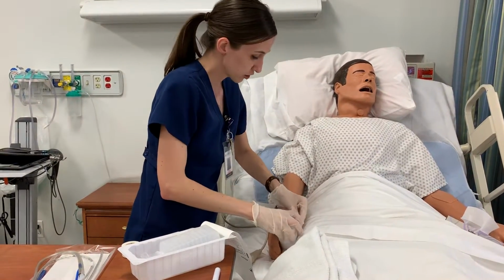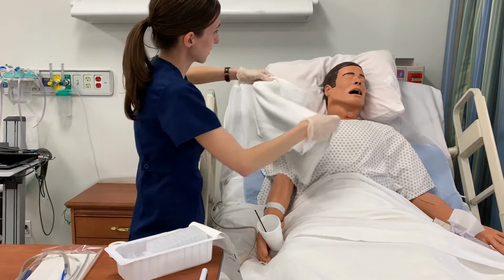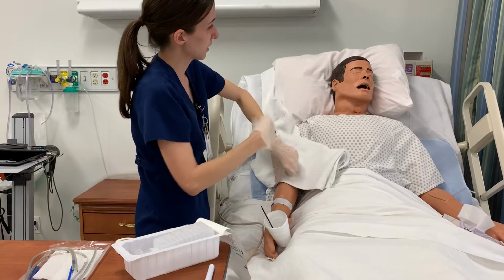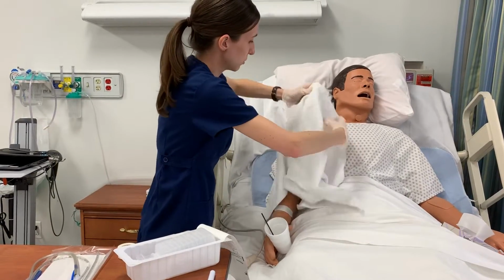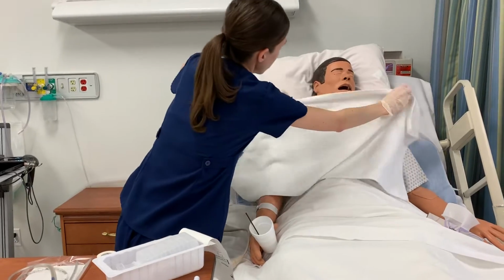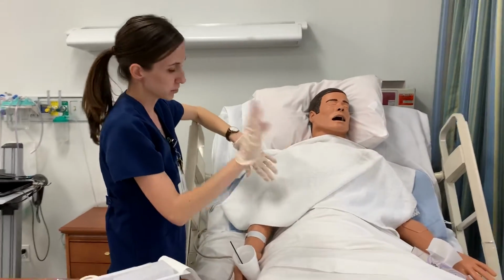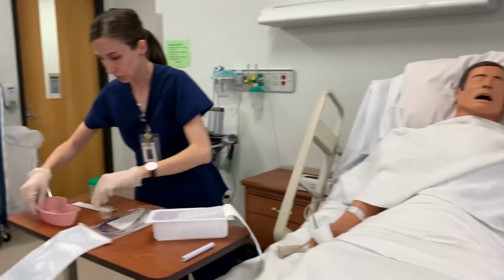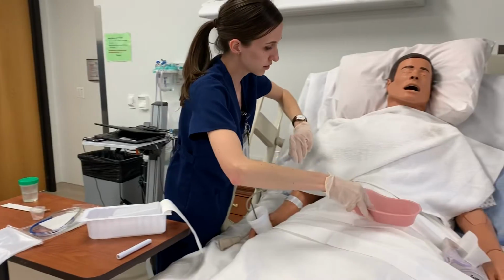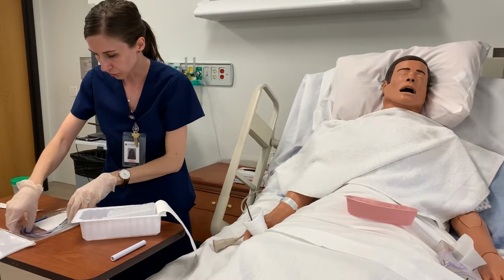I'm going to instruct my patient that during the procedure, I will be asking you to take some swallows, and as you swallow, I will be advancing that catheter. I'm going to place this towel over here. During the procedure as well, if you need to communicate with me at any time and you need a pause, please just raise your hand so I'm aware. I'm also going to have this emesis basin just in case.